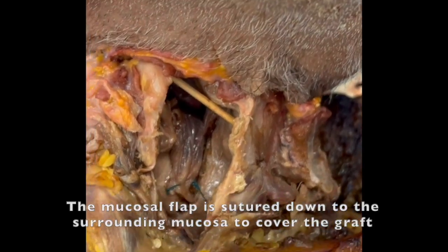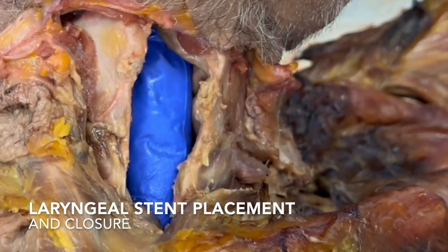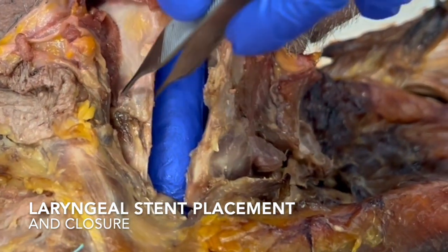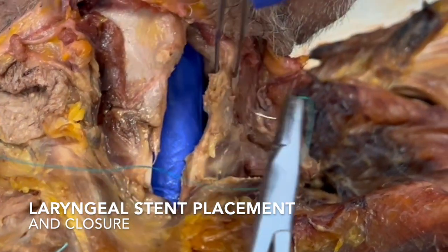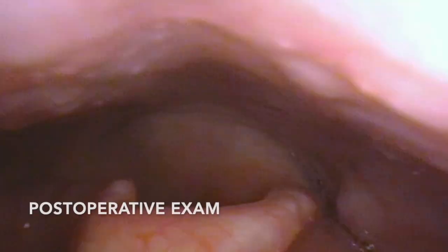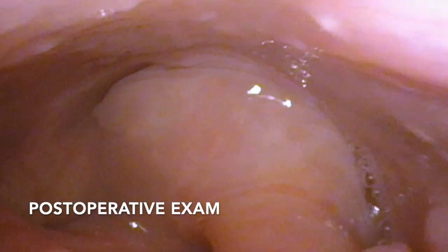This is then covered and stented using a standard medium Montgomery laryngeal stent with typical placement. The laryngeal lumen is then closed using 3-0 vicryl sutures in a standard manner, with the stent removed in two weeks.